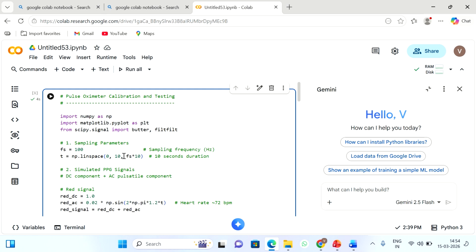Next one, we will simulate the PPG signals, DC component plus AC component, that's all. It is applicable for both red and infrared signals. So red DC signal, we assume that it is 1, and then red AC signal, since it is a sinusoidal waveform, we will take the amplitude of 0.02 and sine 2 pi.